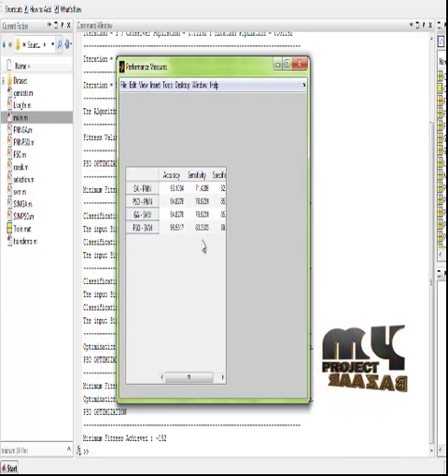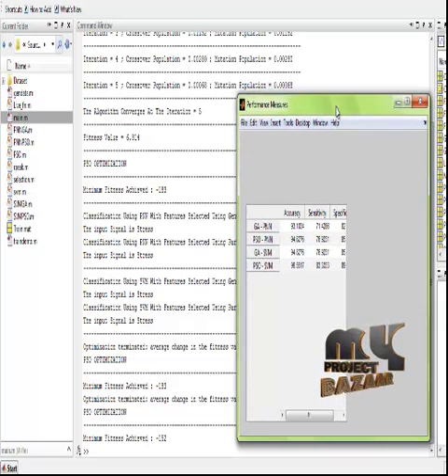Thus we have identified the disease in the ECG signal based on the features extracted from the signal, and we have measured the performance of the process.